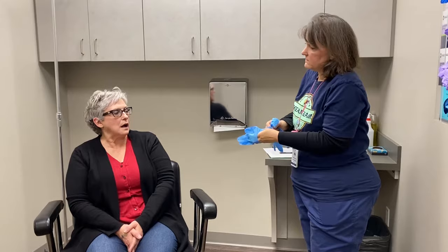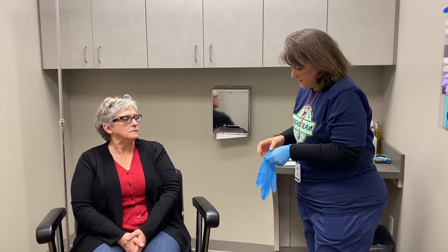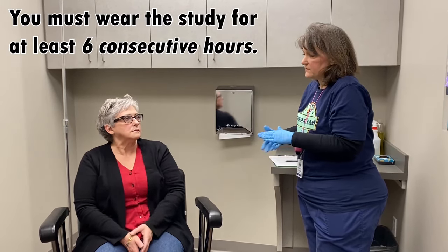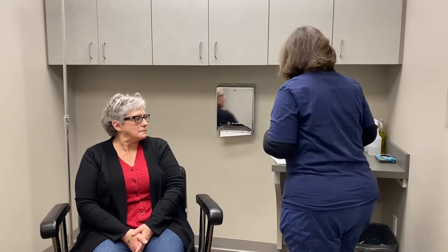So how long do I have to wear the equipment? We want you to wear it for at least six hours. Since you're registered for today's date, we would prefer if you would start the test before midnight — it just makes it a little easier for us with insurance and that kind of thing.